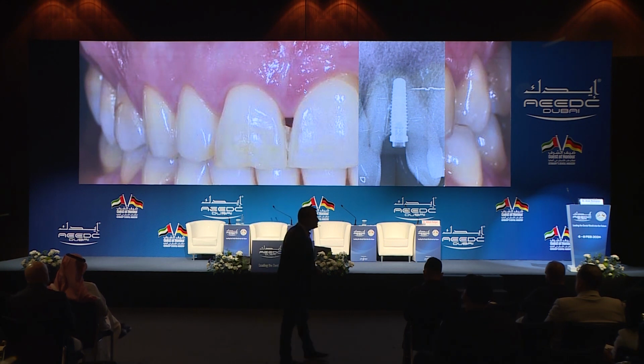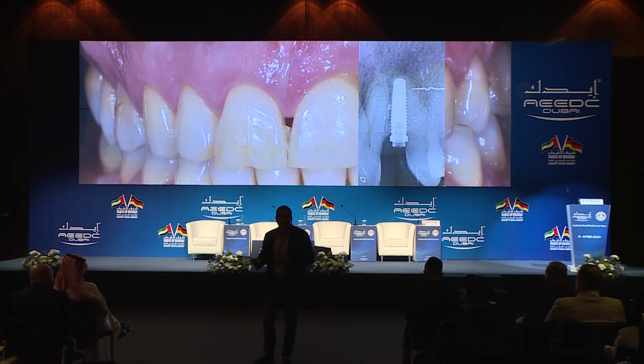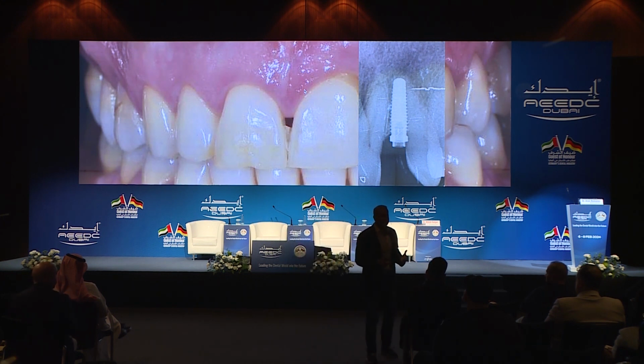And trying to remove this implant back in 2012, we did not have the tools that we have today. You have to remove the implant and the bone with it, and you will affect the bone on the adjacent teeth, on a patient who has a social media company. Are you gonna do this, right?